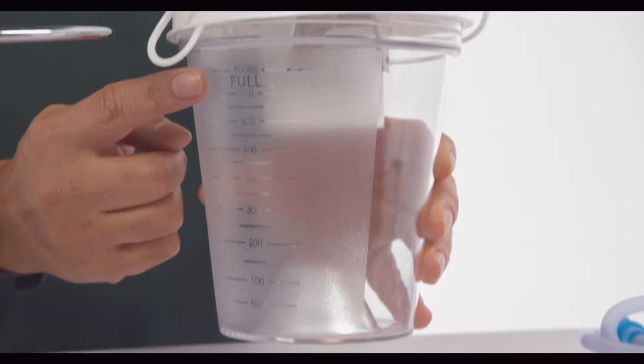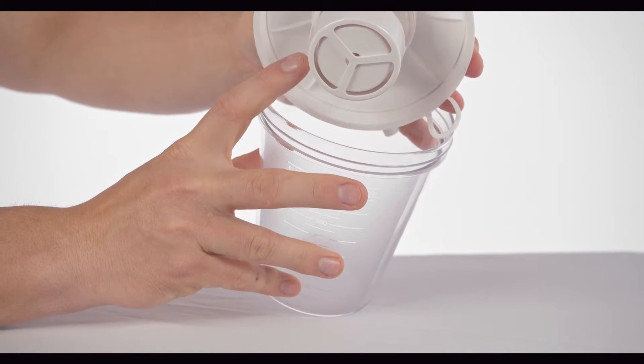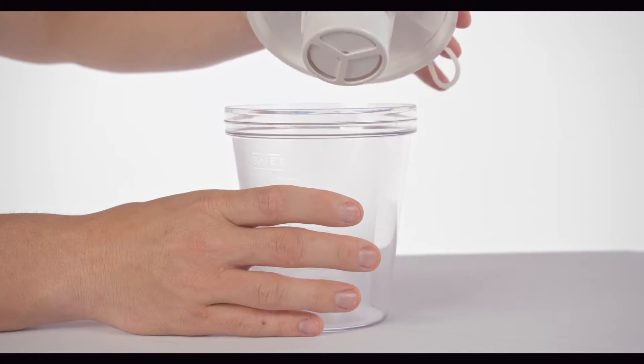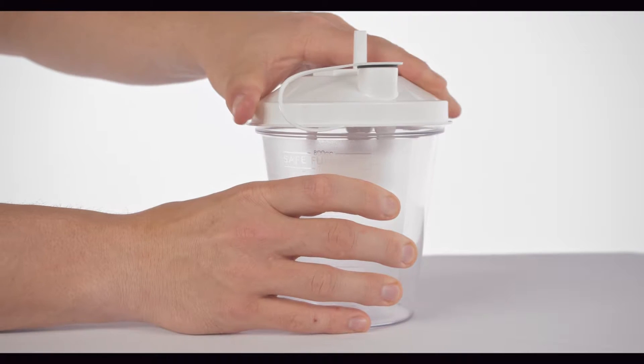The 800cc collection bottle holds all the secretions. The bottle lid, which has a float shutoff to help prevent backflow into the unit when the bottle reaches 800cc, should be tightly secured. Make sure nothing gets tucked underneath the lid.